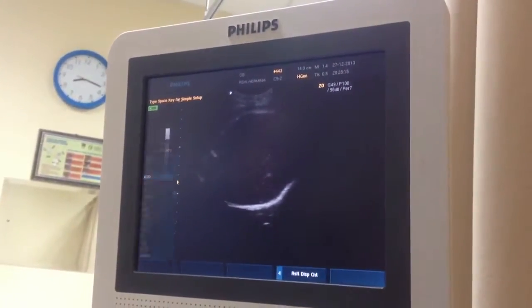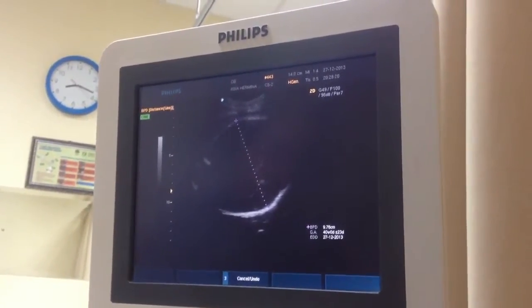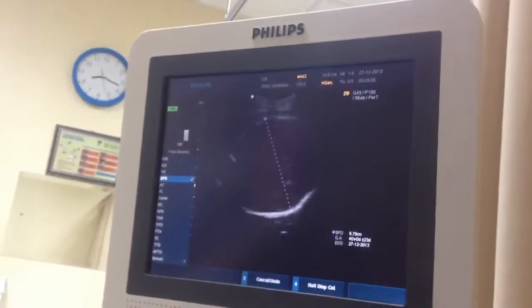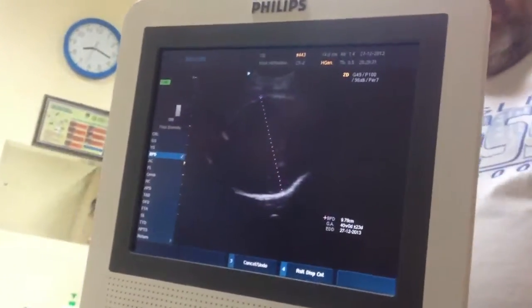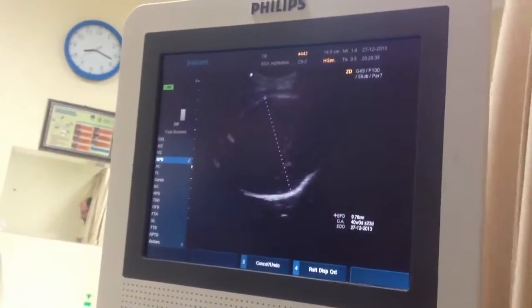This is the diameter from left to right. At one point, we thought the head was somewhere else. Is it possible that the head would move and then come back? Is that pretty much impossible? No, I think it's impossible because the baby is too big. And the water is not too much, so it's very difficult for her to move, to maneuver.